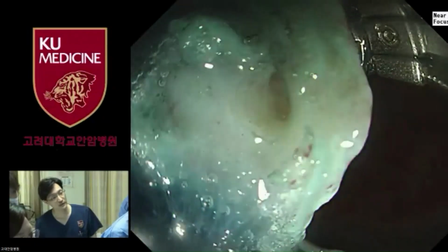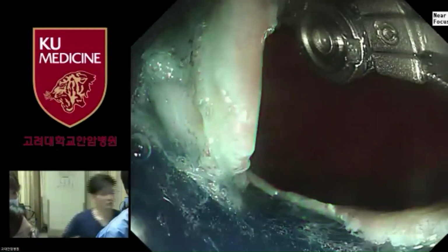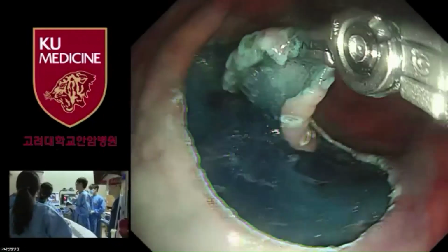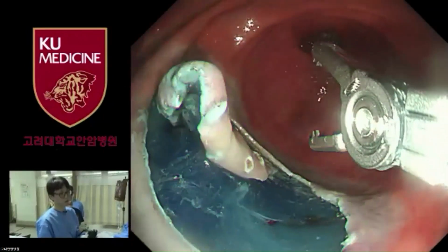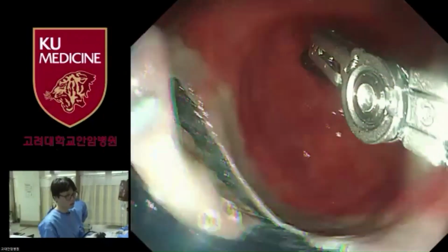and then if there is some bleeding vessel, usually if we just release the specimen, and then you can see that because of the gravity, the flap settles down.